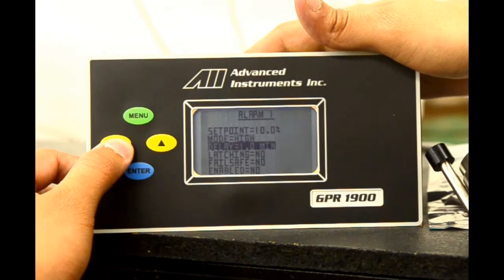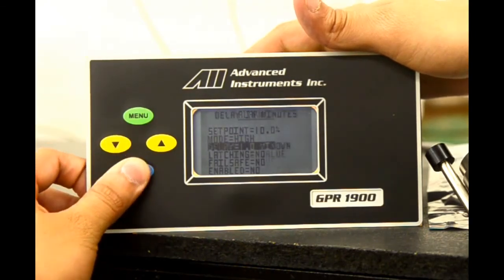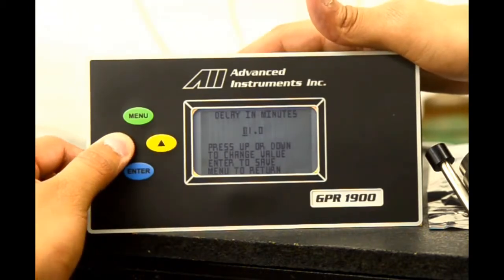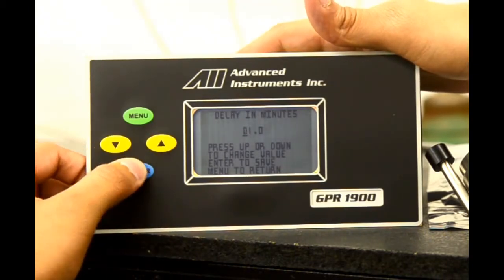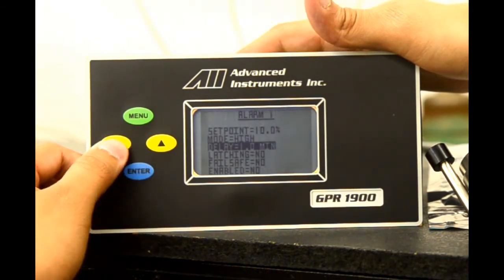We also have a delay function currently set at one minute. We select enter to change that value. The delay allows the analyzer to be under certain alarm conditions for the amount of minutes configured by the user before alarming. This is ideal to prevent false positives.